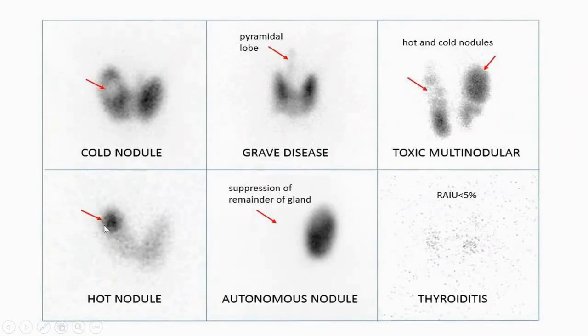So, for example, you all can see this information. This is a thyroid scan. All of this is static imaging. Are there any issues with the images? Look at the video images that I just uploaded.